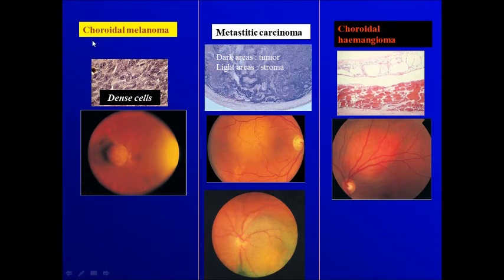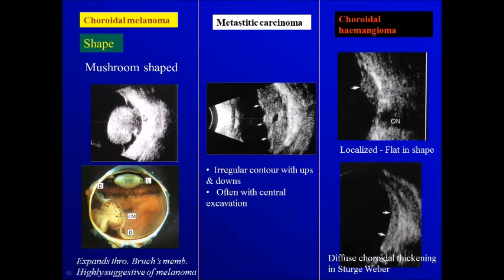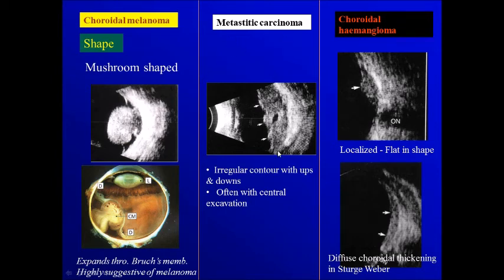To differentiate between choroidal melanoma, metastatic carcinoma, and choroidal hemangioma: first, location — melanoma can be anterior or posterior to the equator, while metastatic carcinoma and choroidal hemangioma are usually posterior to the equator. Regarding shape, melanoma is known to have a mushroom shape — it starts in the deep layers of the choroid, then finds its way through Bruch's membrane, producing a narrow neck and wider top. Metastatic carcinoma is a flat tumor with irregular contour, often showing central excavation. Choroidal hemangioma can be a localized area or diffuse increased thickness of the choroid, as in Sturge-Weber syndrome.